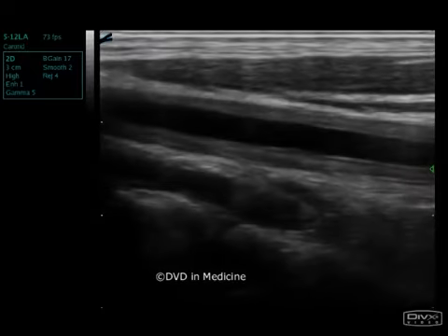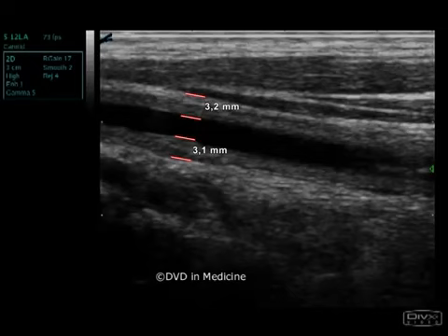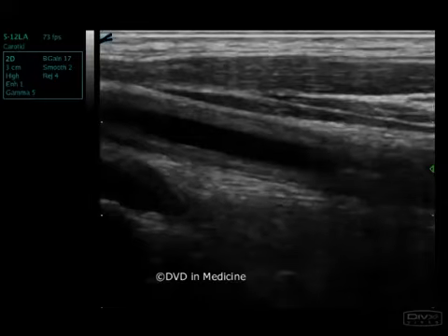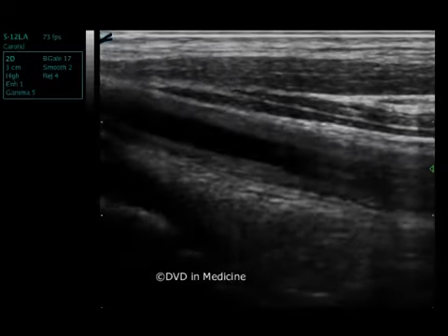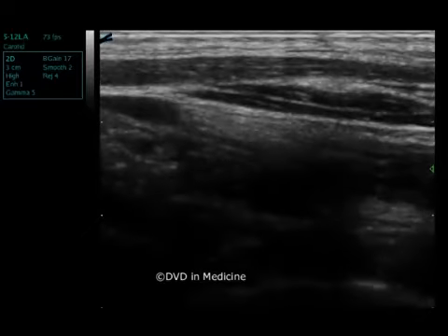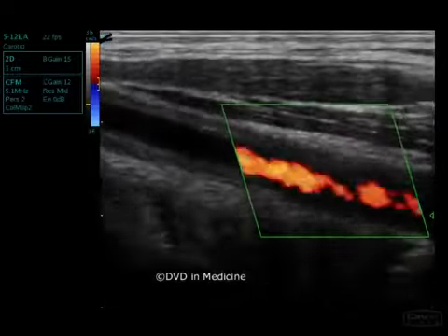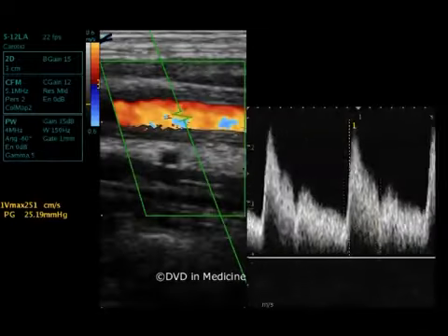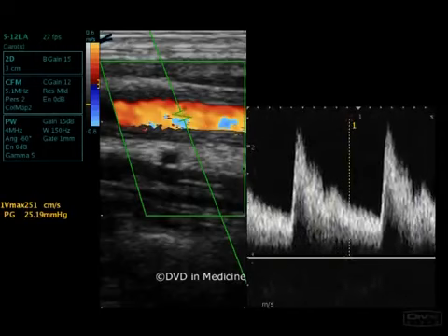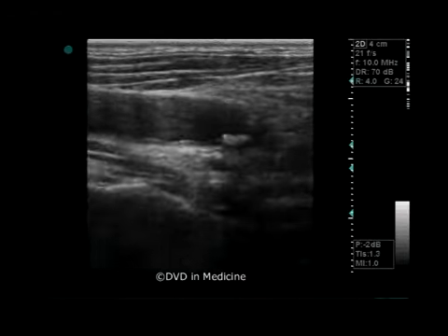After measuring the IMT, one should analyze the internal and external outline of the arteries. The cluttered external outline of the artery and edematous intima media complex can help in diagnosing aorta arteritis. On the other hand, the uneven internal outline could indicate atherosclerosis.